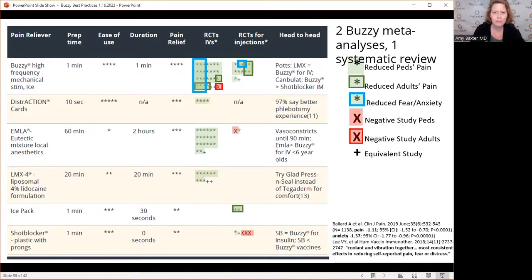So your mileage may vary. Interestingly, the breastfeeding study in the newborn vaccines and the recent one with the measles, mumps, rubella, they both did use the ice, and it was a significant benefit. Anonymous attendee, did that answer your baby question, or do you have a more specific one?